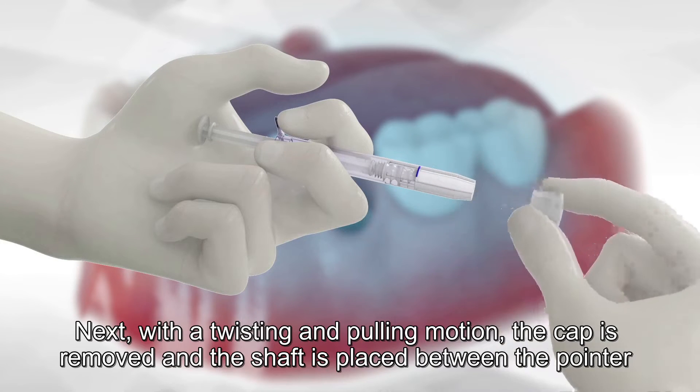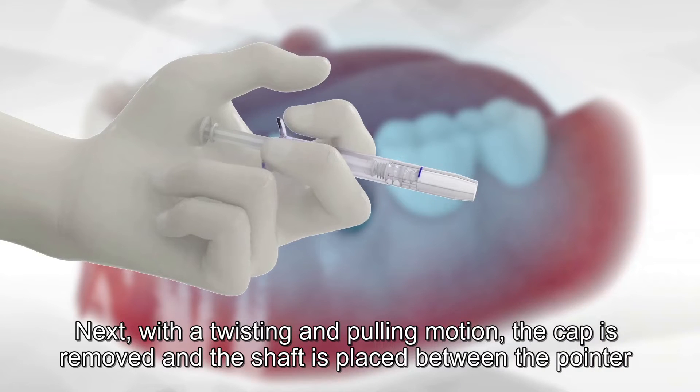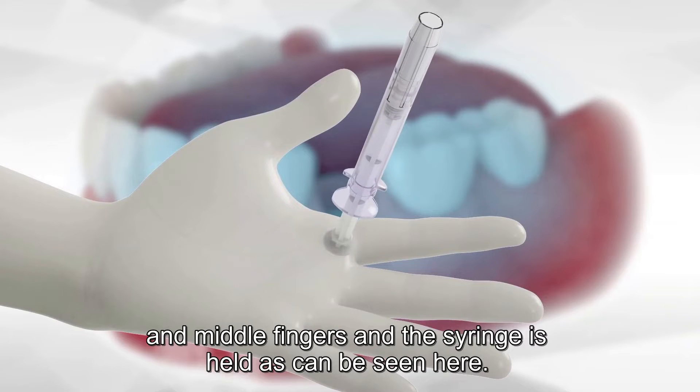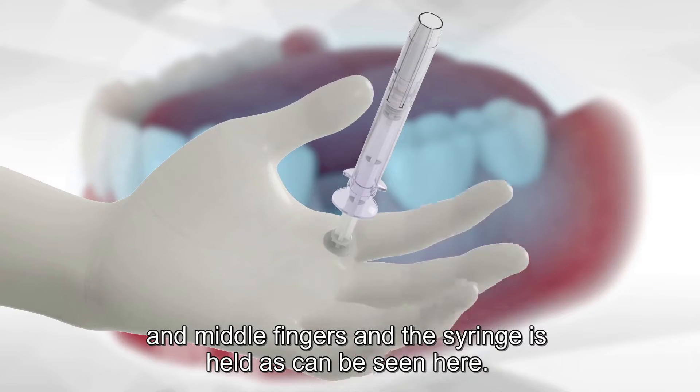Next, with a twisting and pulling motion, the cap is removed and the shaft is placed between the pointer and middle fingers, and the syringe is held as can be seen here.